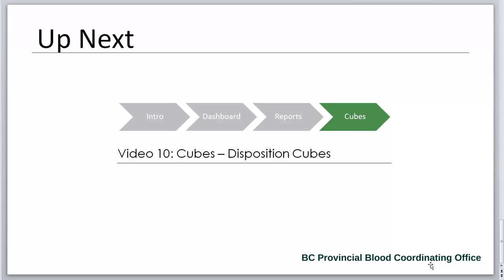Next, we'll take a look at the disposition cubes and the types of data we can find inside those.